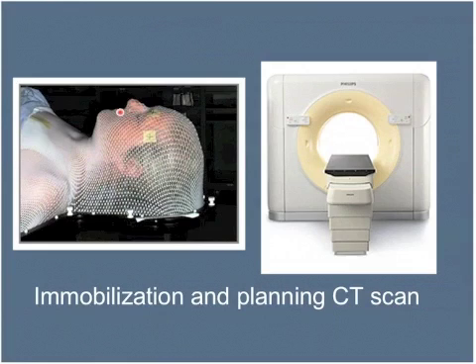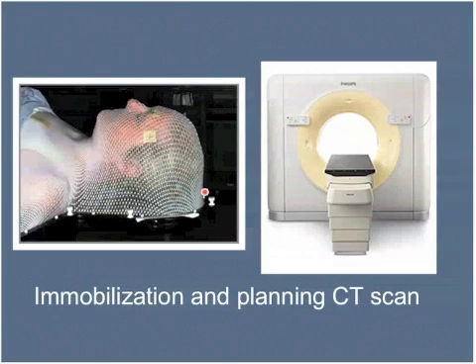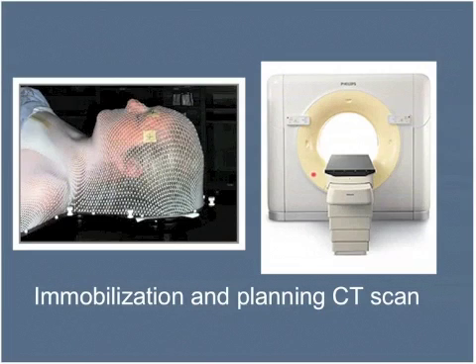So for treatment planning, we include a form of immobilization. This is probably the simplest form of immobilization, which is a thermoplastic shell. You can see that there is immobilization under the chin and the shoulders, and this is important. It takes the head tilt out. There is a setup mark here that is aligned to lasers in the room to allow precision localization each day, which can also be coupled with in-room imaging to refine the positioning of the patient. And these devices are custom fabricated for each individual, and this is done prior to acquiring a volumetric CT scan, which basically gives us the 3-dimensional imaging that we need and electron density information that we need to segment out and calculate dose for treatment planning.